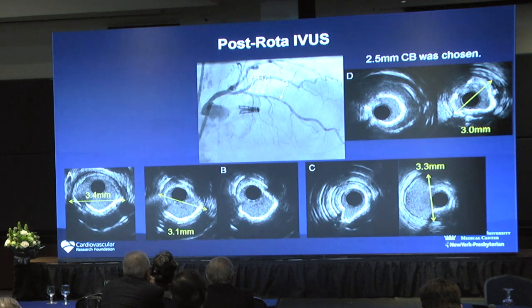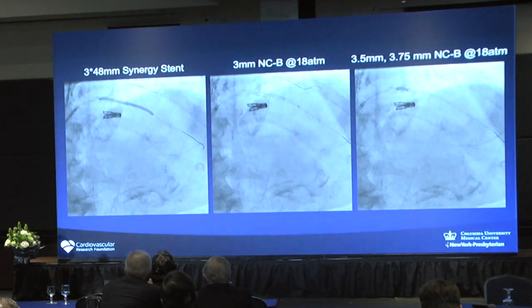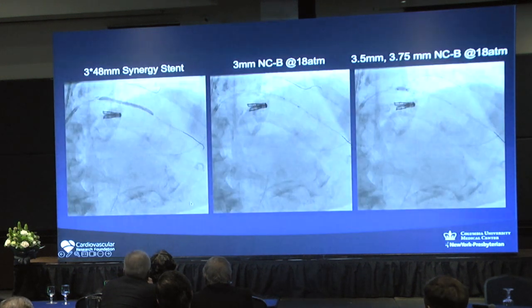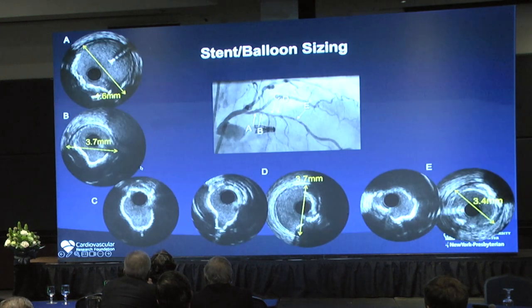And next, okay, it looks like it's stuck. Oh, okay, sorry. Okay, so next, I think we did the cutting balloon. So I want to go back. Can you go back to before? One before. One more. Thank you. One more. I'm sorry.